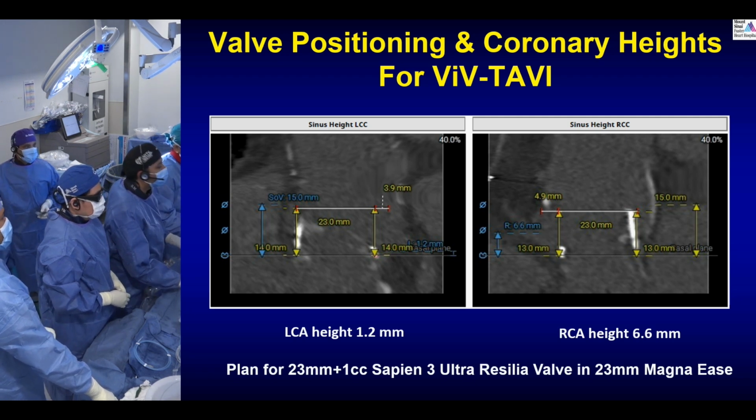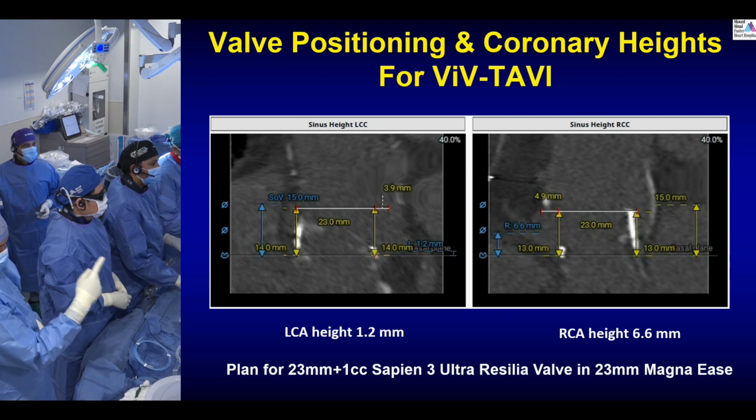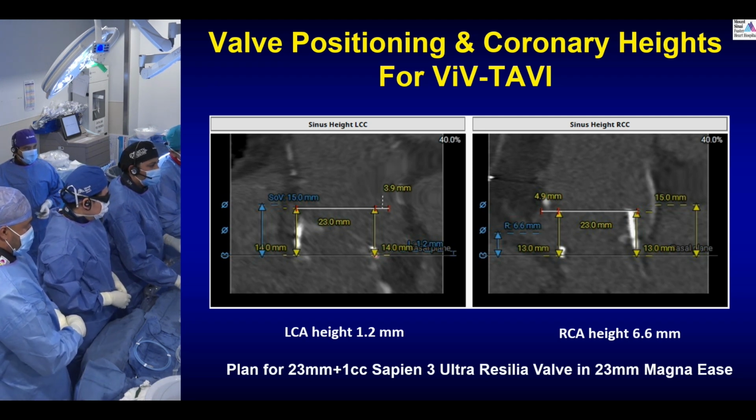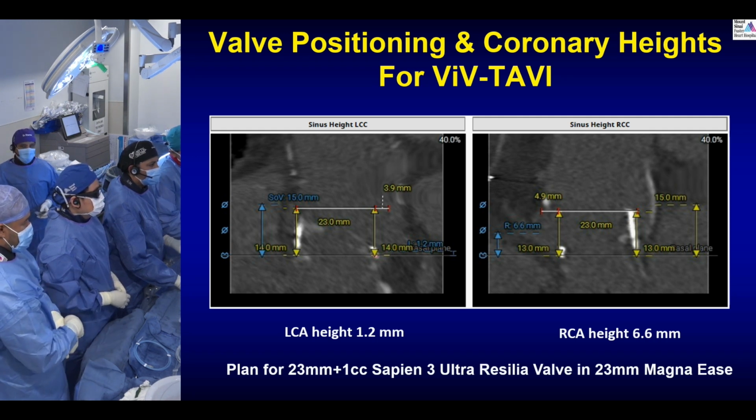Can you show us the CT? There is a dissection from the descending aorta going to the aorto-iliacs. Now the access and how you manage the access, we are very keen to see that. Yeah, we'll show that also. Beautiful case. Yeah, we will show you the access for sure.